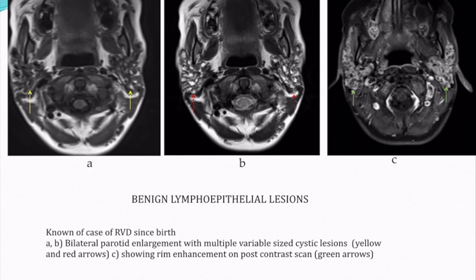A known case of HIV since birth showed bilateral enlargement of the parotid gland with multiple solid-cystic lesions and homogenous rim enhancement on post-contrast scan. The diagnosis given was benign lymphoepithelial lesions.